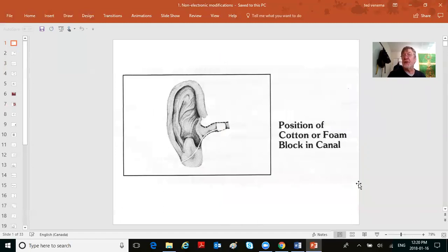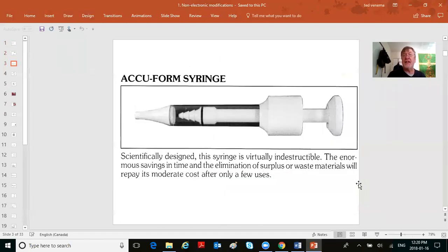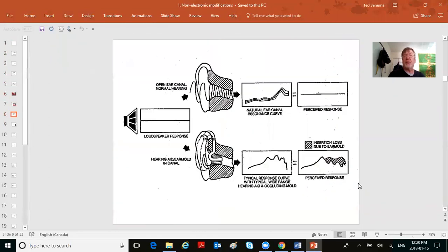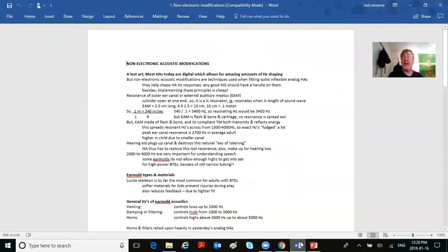Anyway, okay, we're talking about taking ear mold impressions. You all have done some of this already, okay? But we'll be moving from ear mold impressions and then talking about really here. Now look in your notes, and all I'm going to do today in the last 10 minutes is finish the top third of page one. Read with me. It's really a lost art.